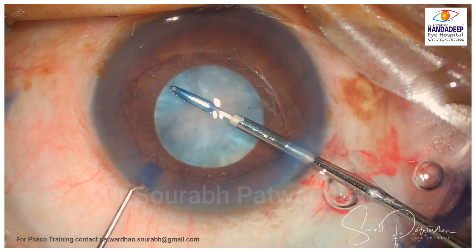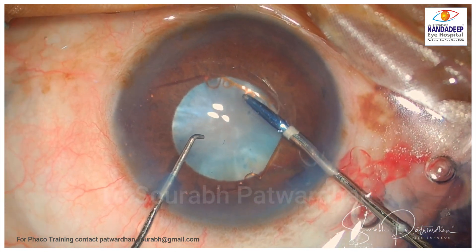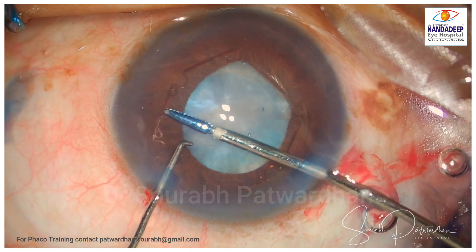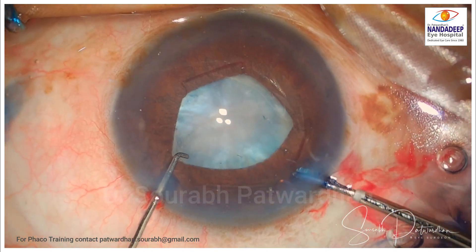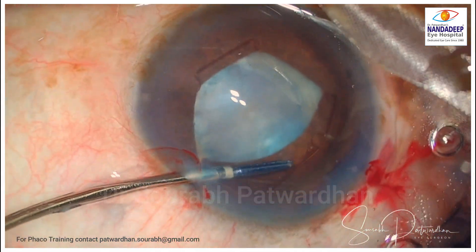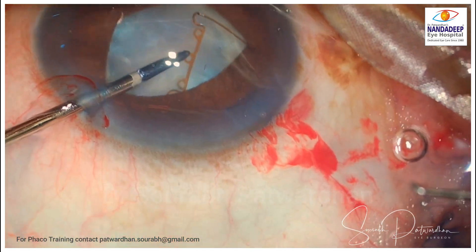Though it is a shallow anterior chamber, it is not an intumescent cataract as you can see from the anterior capsule — it is not bulging, though there is some fluid cortex there. I am going to use the B-hex pupil expansion ring, and I have already shown videos on how to insert it. In such cases where the pupil is a little rigid, you may face difficulties putting the third flange.